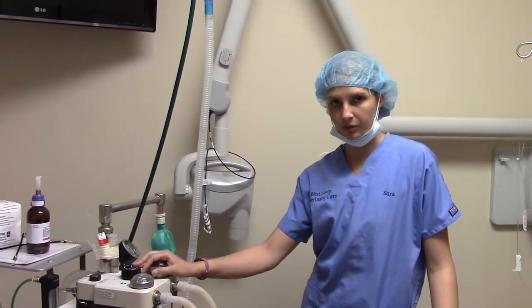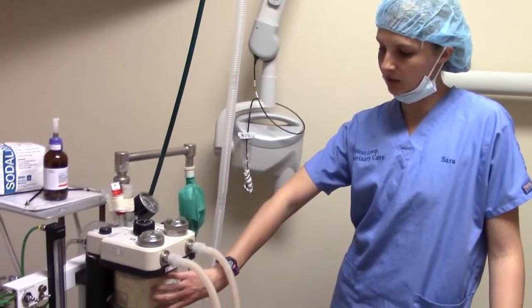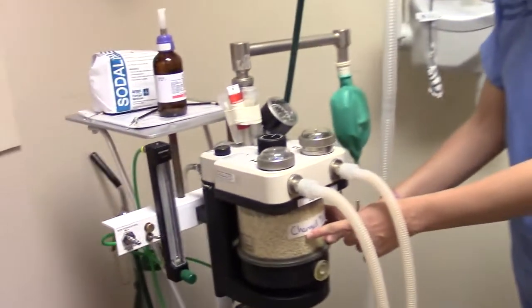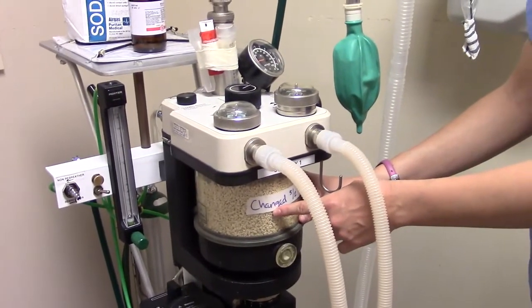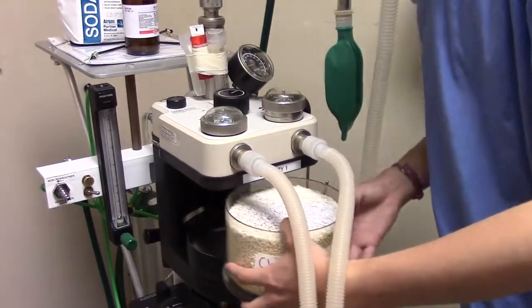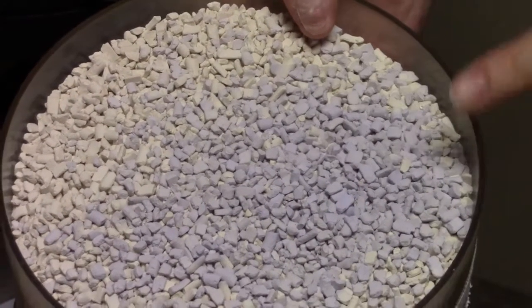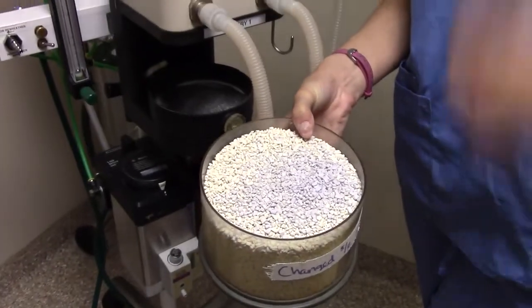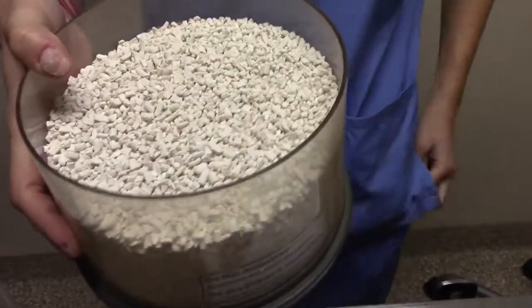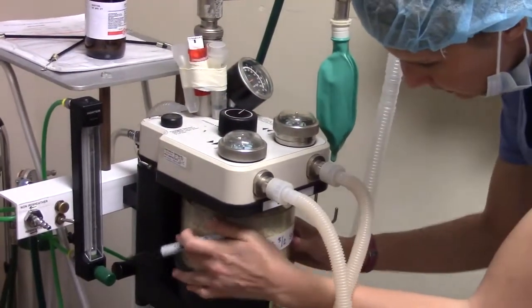A couple other things to check before we put our patient under anesthesia. We're going to check our soda lime granules — these take out expired carbon dioxide. As you can see, they should be white. When they've absorbed too much they'll turn purple. So unfortunately, this is why we check — these are purple, meaning they're past their expiration. We're going to go ahead and change these out. Now we've changed them and they're white. We'll change the date on the outside, make sure it's fully closed.